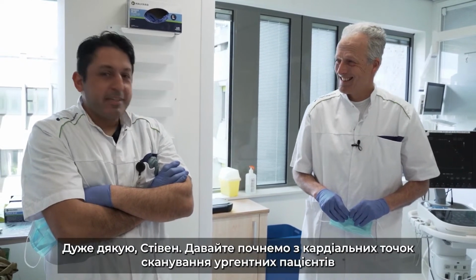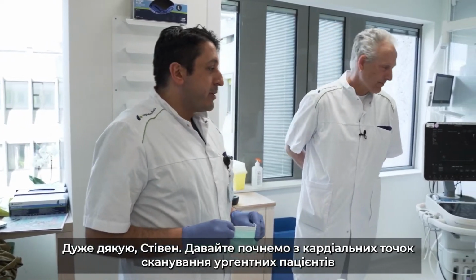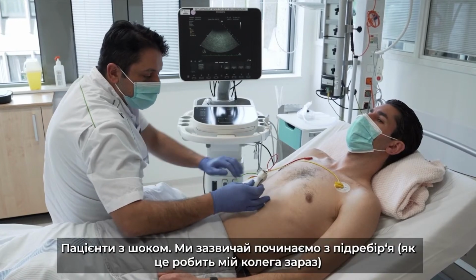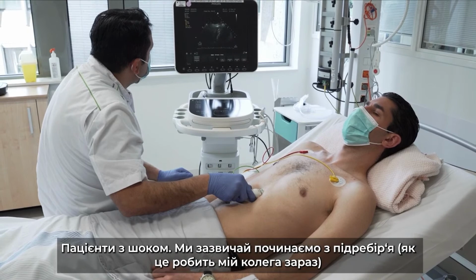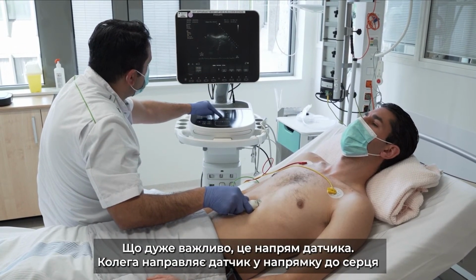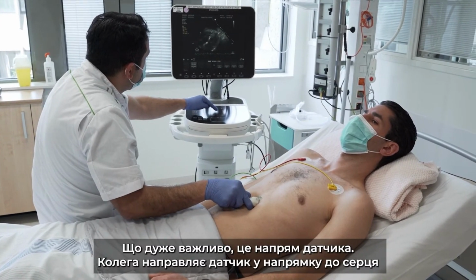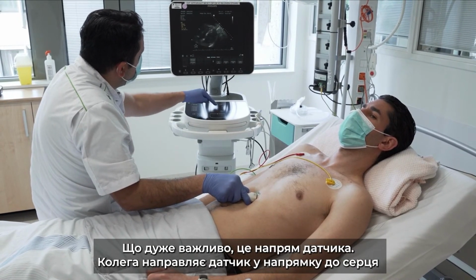All right? Thank you very much, Steven. Let's start with the cardiac windows in acutely ill patients. We start in shock patients. We usually start with the subcostal view, as you see my colleague doing here. What is very important is the direction of the probe. He is directing the probe in the direction of the heart.